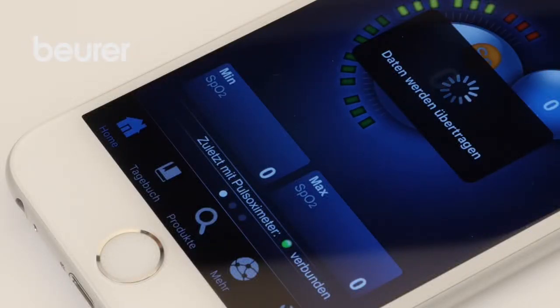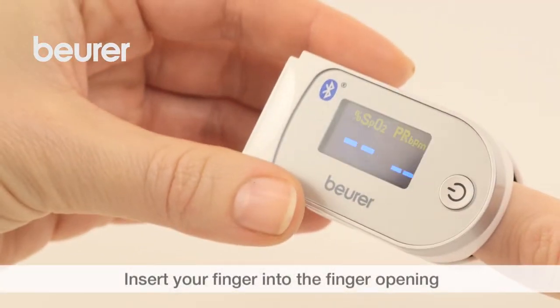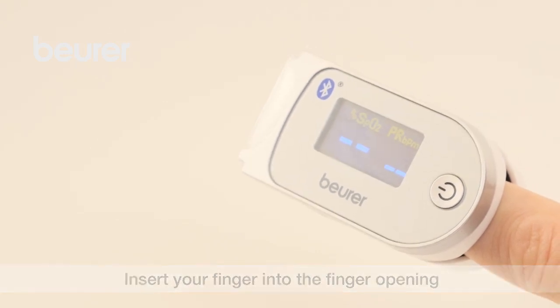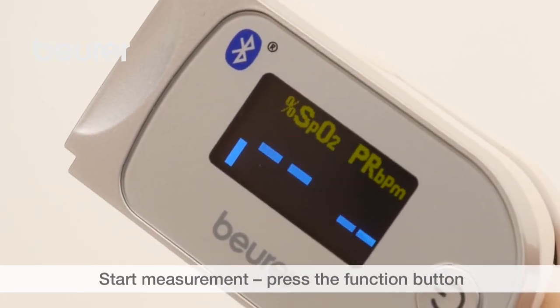The measured values can only be transferred when the Health Manager app is open. Switch on the device by pressing and holding down the function button. To take a measurement, insert your finger into the finger opening of the Pulse Oximeter. Hold your finger steady, then press the function button and the measurement will start.